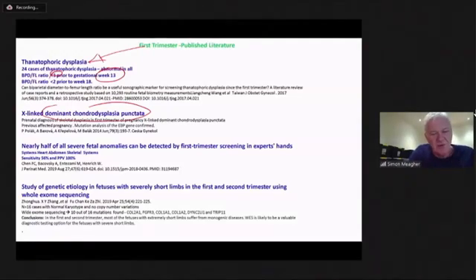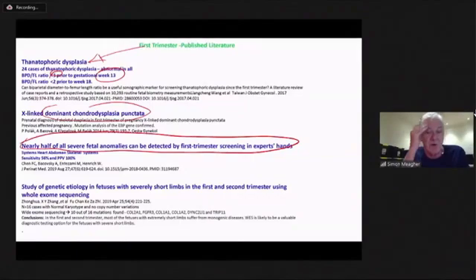What's important, though, when you look at the first trimester, when we talk about identifying half or more in Syngelaki's recent population screening of 100,000, we talk about detecting abdominal wall defects, cardiac defects, but next on the list is skeletal. And exactly the point, Prashant, that you made at the very opening of the seminar this evening, was we are very good in a sense of identifying that there's a skeletal problem. What we're not so good at is actually classifying it.